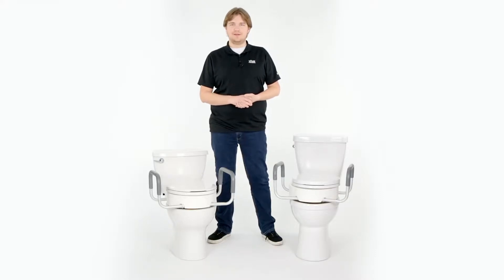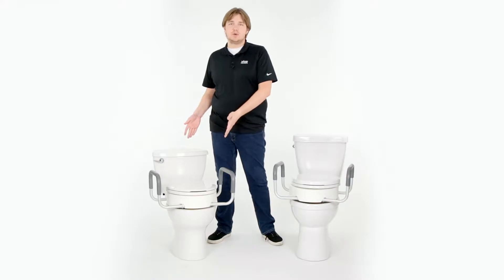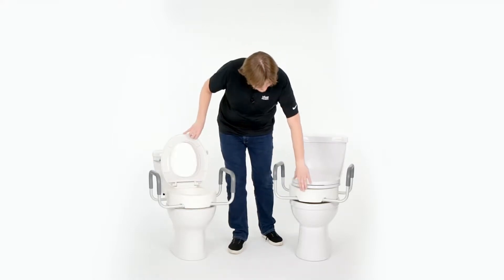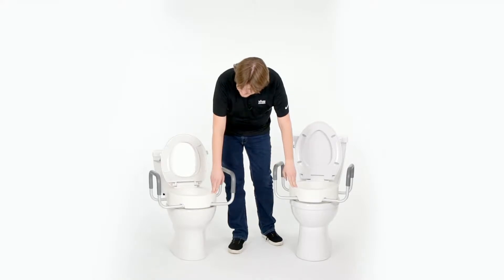Hi, this is Devin from VIVE Health. Here we have a standard size toilet, and here we have an elongated toilet, and installed on each, beneath the seat and the lid, is our VIVE toilet seat riser.